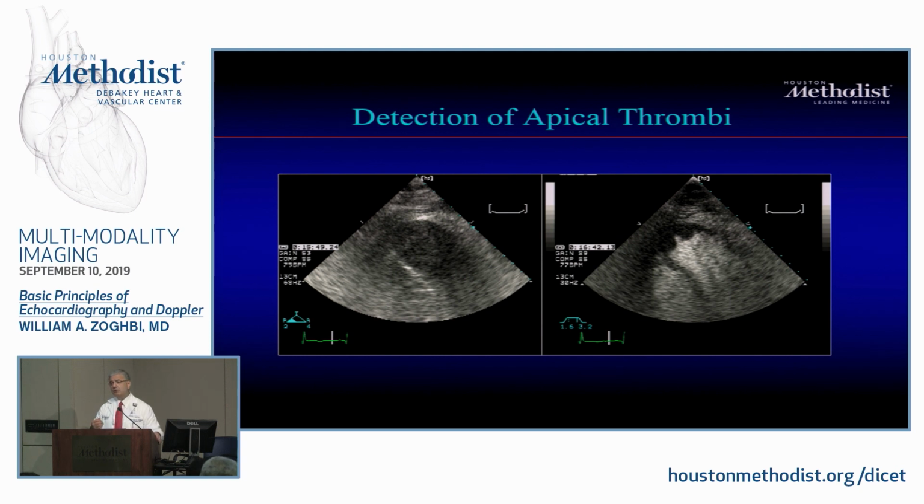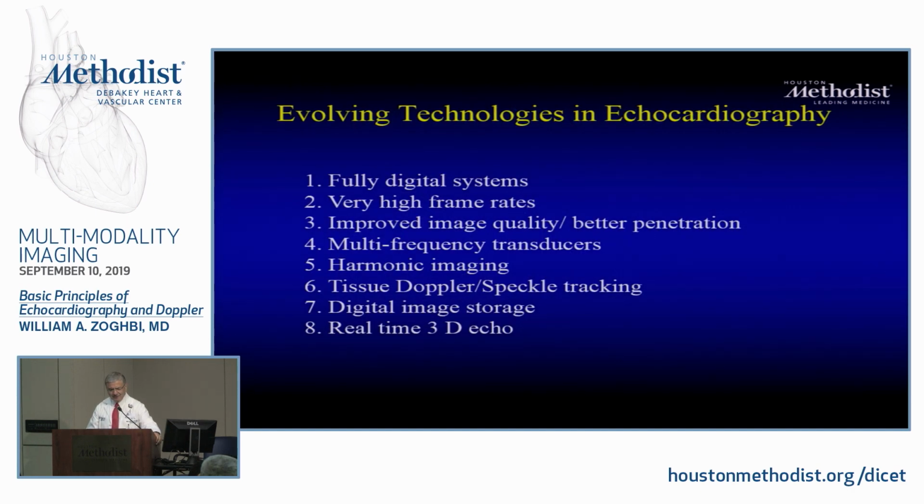There are different ways also, if you didn't have contrast, if you're stranded on an island without contrast, but you have your pocket ultrasound, there are ways to do it, right? You could change maybe the frequency. You could change the interrogation. I could do a short axis as opposed to an apical view, so get away from the reverberations. There are different ways for you to do it, but I know you're not stranded except here in Houston, Texas.